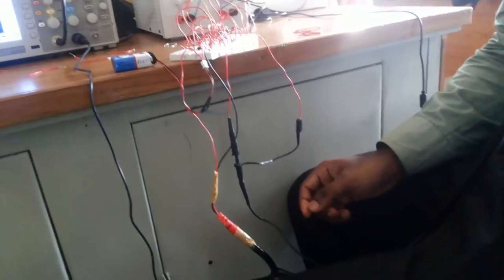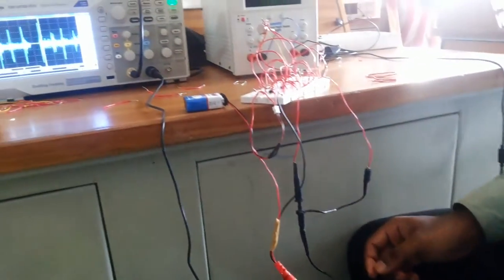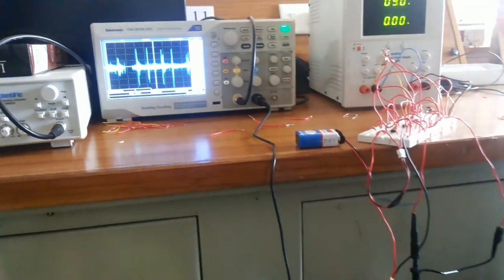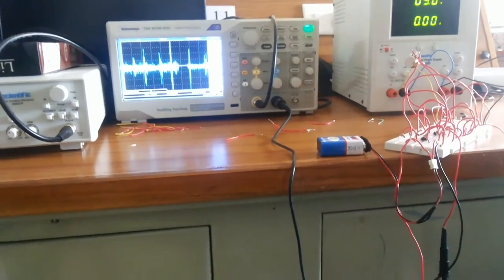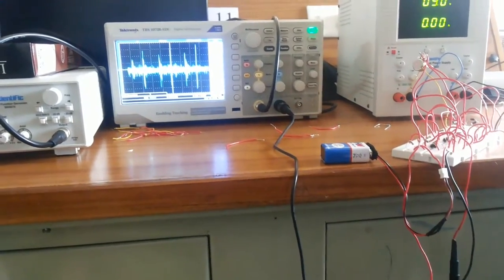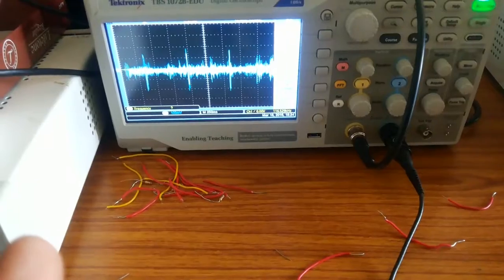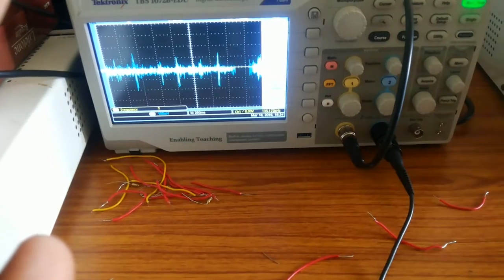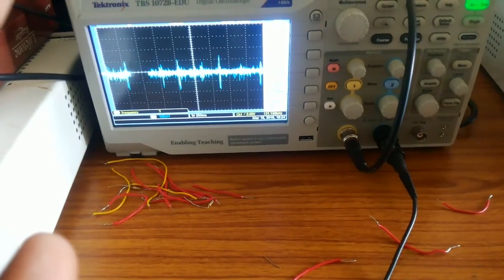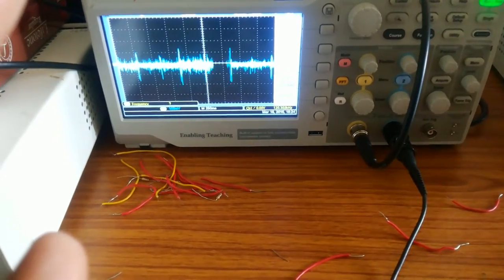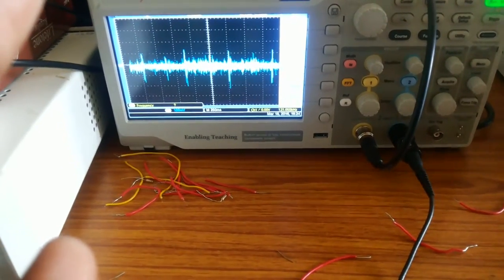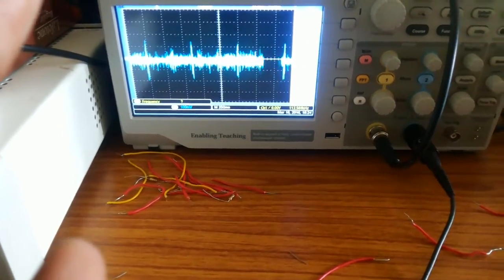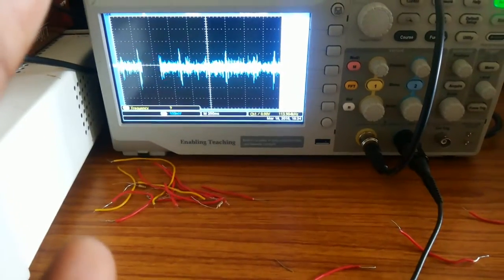The filtered signals are then amplified by variable gain amplifier. These signals are acquired as signals in CRO. We can observe S1, S2 peaks in the output. We can even modify this project by interfacing with LabVIEW software.